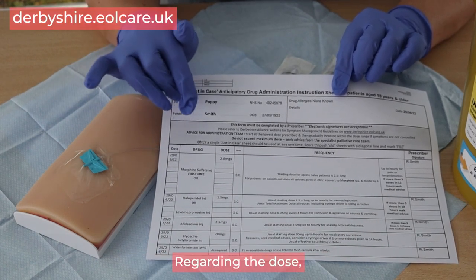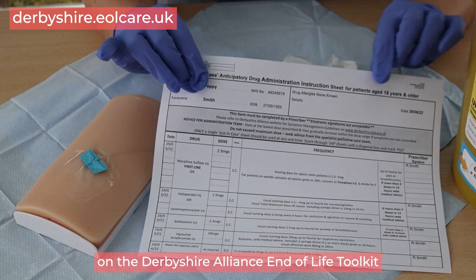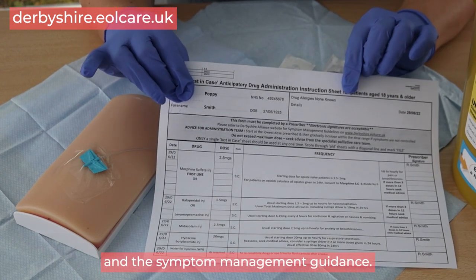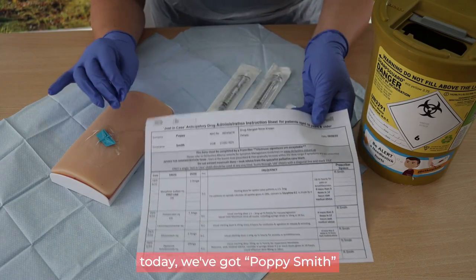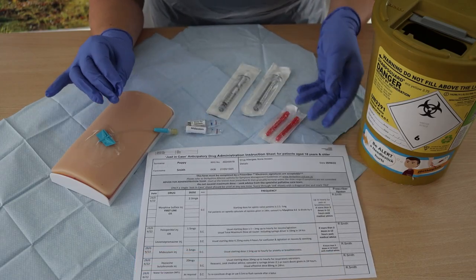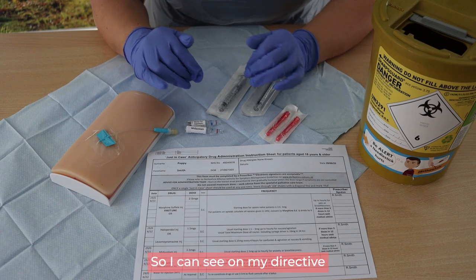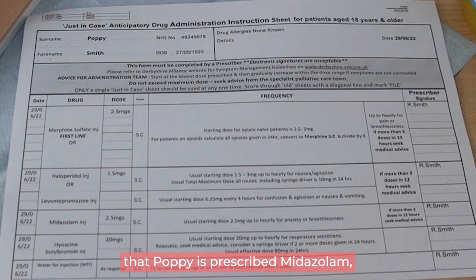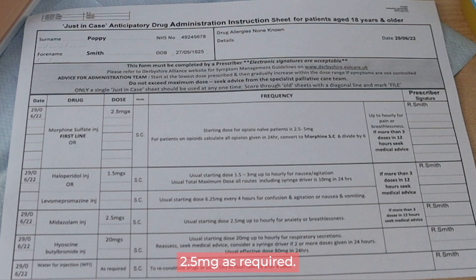Regarding the dose, you can find this information on the Derbyshire Alliance End of Life Toolkit in the Symptom Management Guidance. So for this demonstration today, we've got Poppy Smith and she's needing some midazolam. I can see on my directive that Poppy is prescribed midazolam 2.5mg as required.